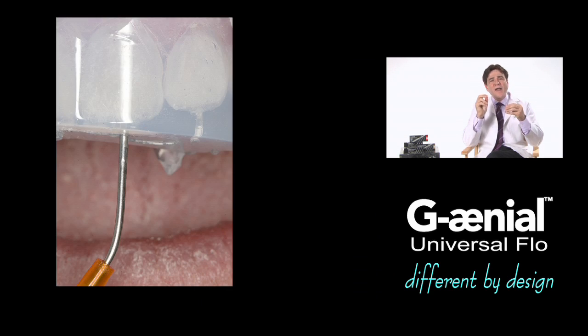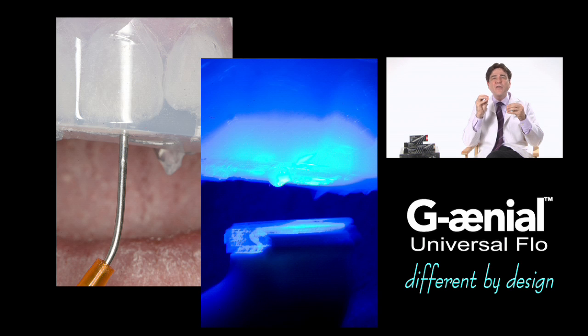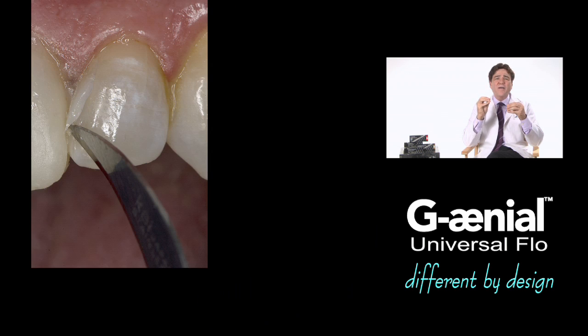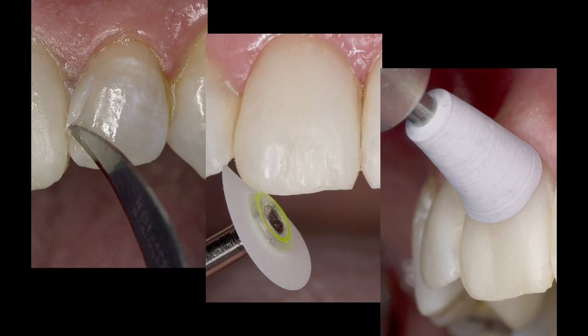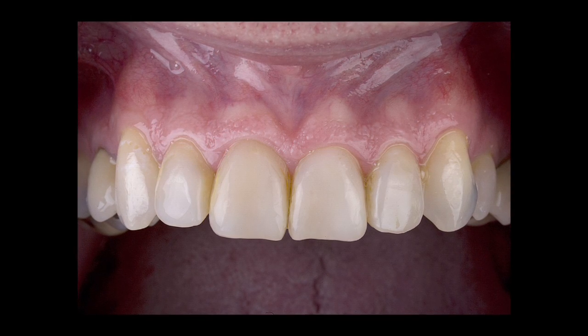A clear vinyl polysiloxane impression can be used to replicate the diagnostic wax-up. The matrix can be placed intraorally and used as a transfer vehicle for the flowable composite to be injected.